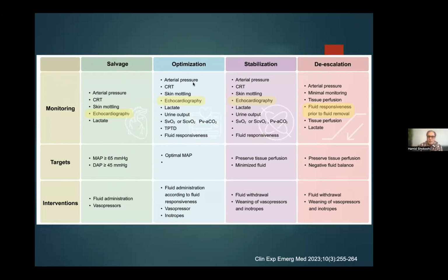You see, okay, now let's look back. How much fluid did this patient get? Okay, do we need more or less? How much pressure is that? Do we need a second pressor to start? All those things, and stabilizing it. So now, okay, we are good. We are going to put the low dose of pressor and we have a lower dose of fluid, and we stabilize this one.